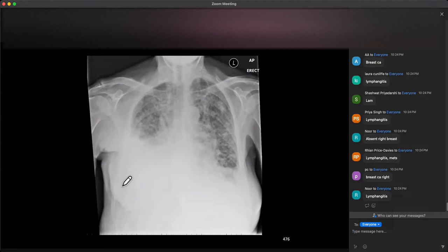Presumably, the patient has got a fungating breast cancer, or alternatively, they've had a partial mastectomy on the right-hand side. But the indication that this patient has got malignancy of the breast is evident by the asymmetry. And so this is breast carcinoma, pleural effusion, multiple metastases, and evidence of either a mastectomy or fungating lung cancer. Sorry, fungating breast cancer. My mistake.